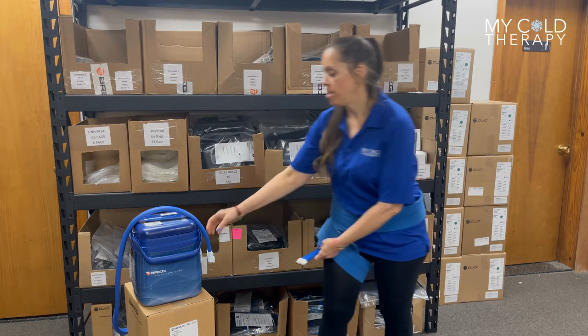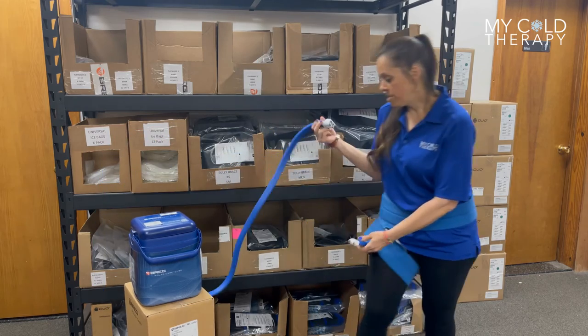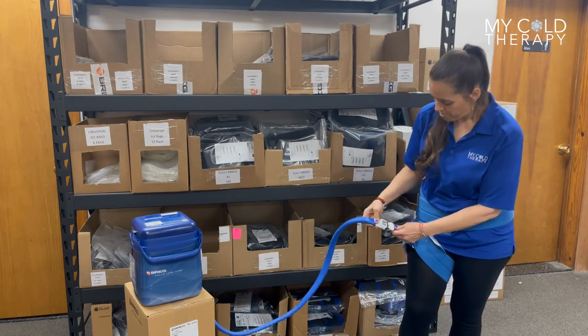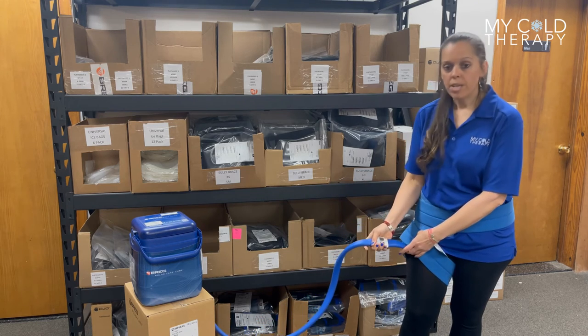Then you're ready to connect to your system. As you can see, these have a pretty good size hose length on them. Click it into place and you're ready to go.